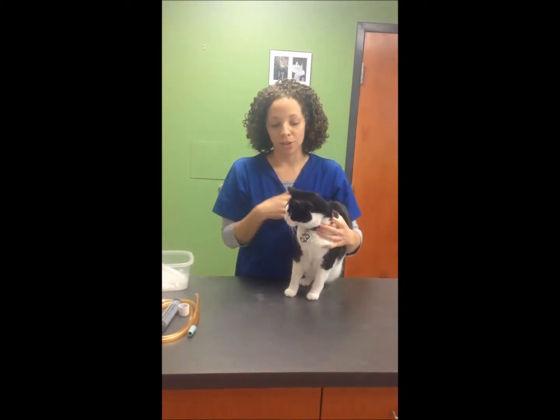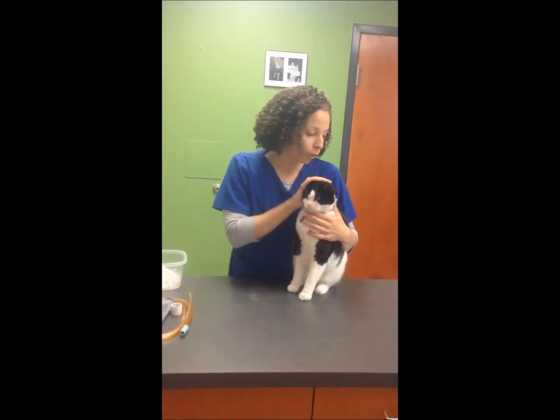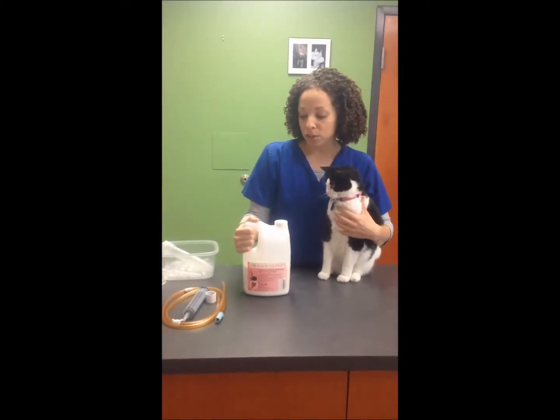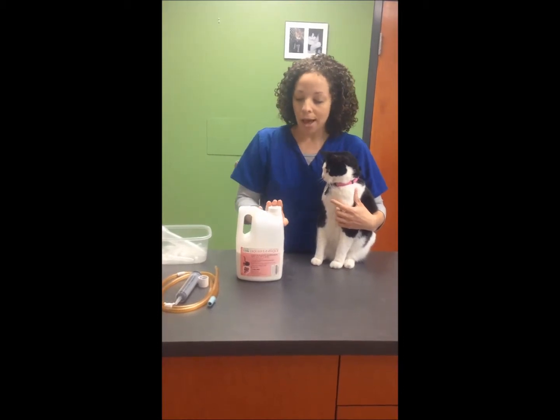Some sedation may be required, which again, you just want to base on how it goes. So what we're going to use for this positive contrast study for her is a barium sulfate suspension 60%, which is the most common one that's used for upper GI contrast studies.